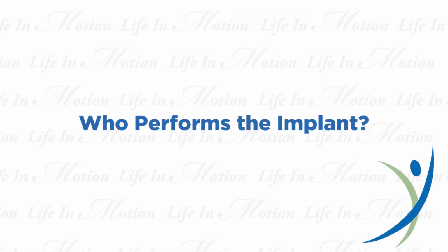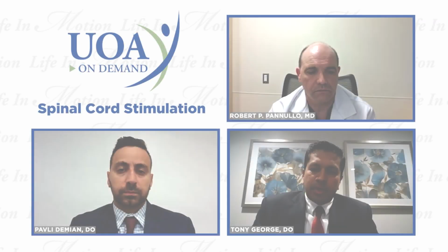And Dr. George, when it comes to implant, who does the implant? And what are my options if I was a patient who had a successful trial? Typically, the implant can be done by a spine surgeon or an interventional pain physician who is adept at doing these implants. And they can do it through one of two ways. One is using paddle leads, or one is using percutaneous leads. And that determination is made based on the patient's anatomy.